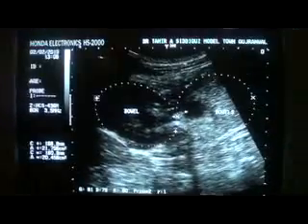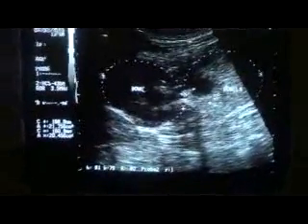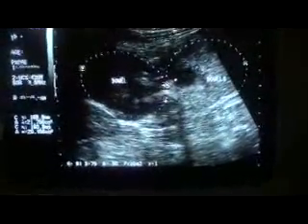Thank you very much. Now you see in this case, this is the distended bowel segment, and we can see this one that has been transformed into a cystic area with echoes within it, and the lumen is protruding into this bowel segment.